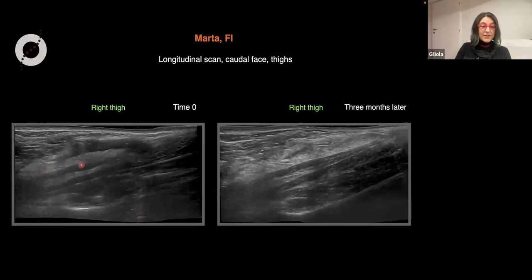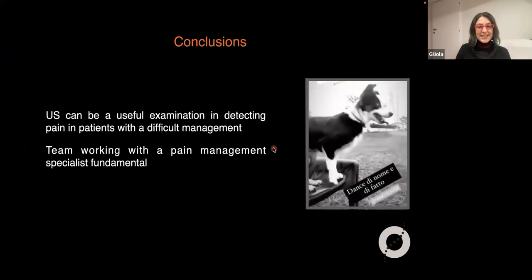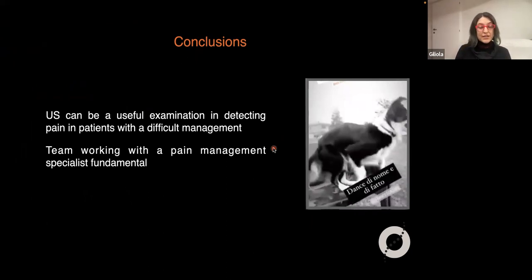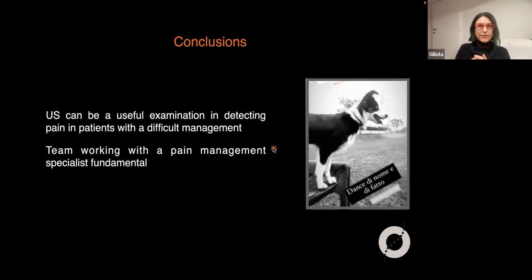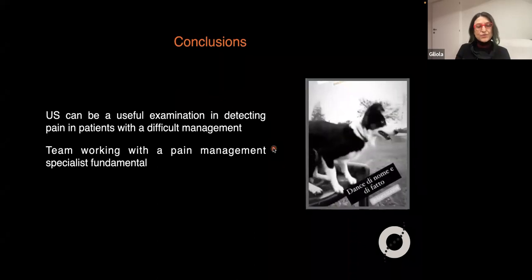Acute with scattering artifact, and chronic with more defined muscle, much better defined because there is not a lot of scattering artifact. This is just to let you see how we can see the difference. These were my 3 patients, and I think they show you how you can use ultrasound to better define the lesion, especially in tendon and in muscle, that can be so difficult to treat in a systemic way, while it's so good to treat locally.